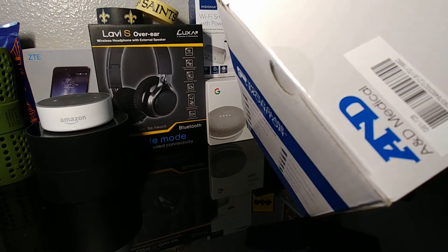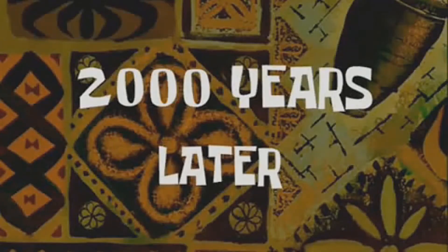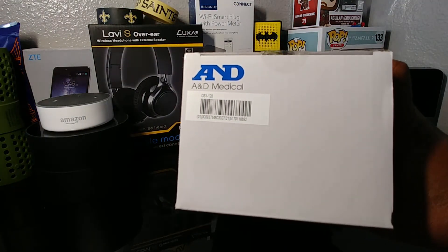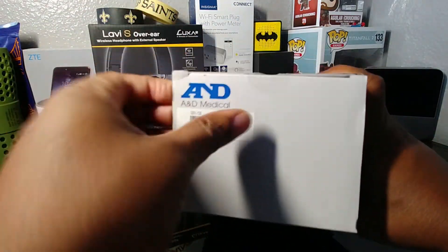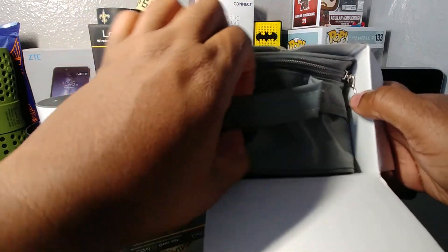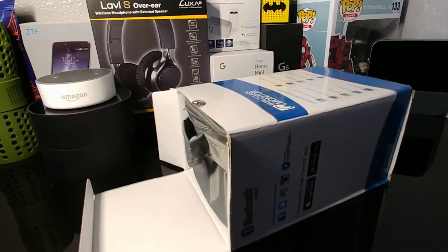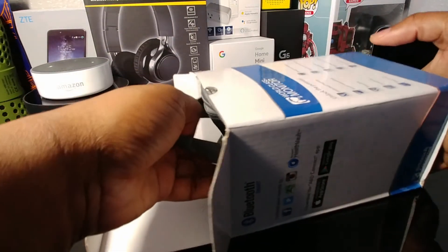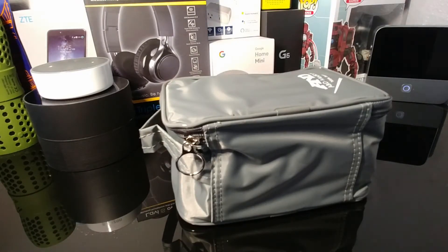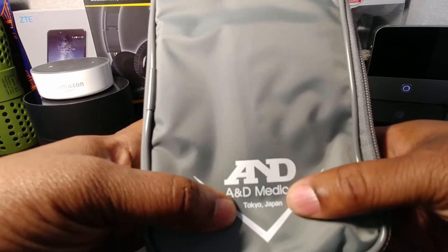Let's go ahead and open this up — and right off the bat, the tape, I never win with tape. All right, here we go. So right when you open it up it comes in a carrying case, which is pretty nice. Nice little carrying case with the A&D Medical branding logo on there — from Tokyo, Japan.